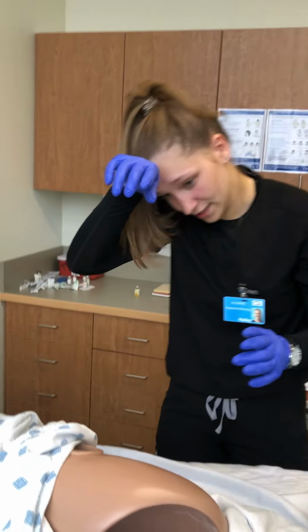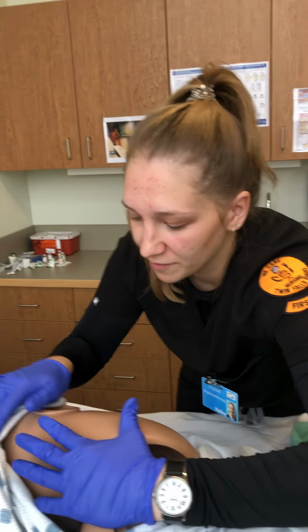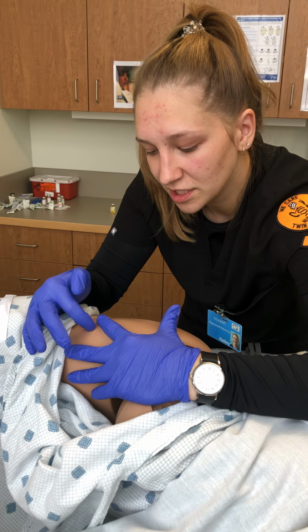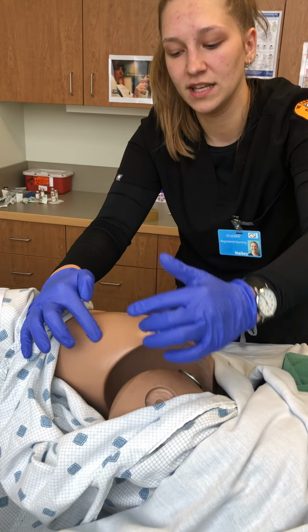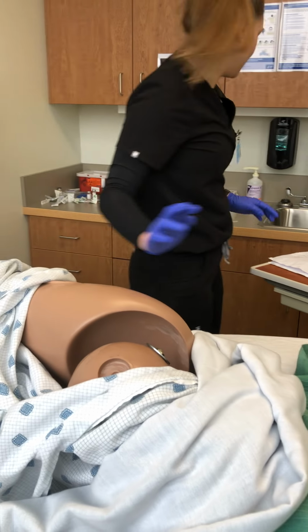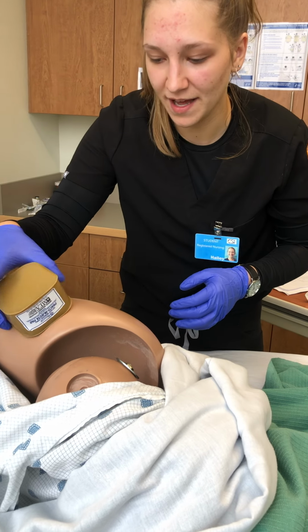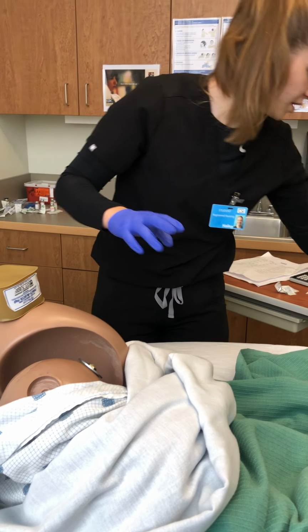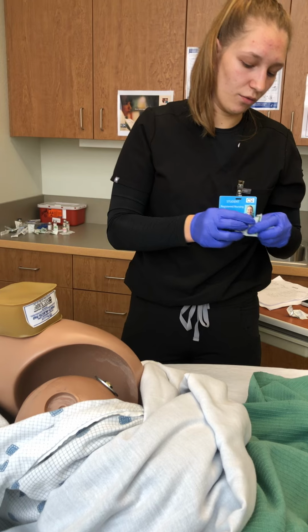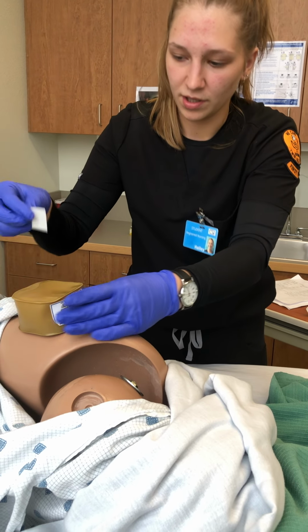To find this, I'm going to put my hand down on the hip bone and find the top of the iliac crest with my middle finger. Spread my fingers out wide, and I'm going to be administering it right here where this big, nice muscle is on her. So I'm going to mark that place. I'm going to grab my alcohol pad, wipe this down, and let that dry.